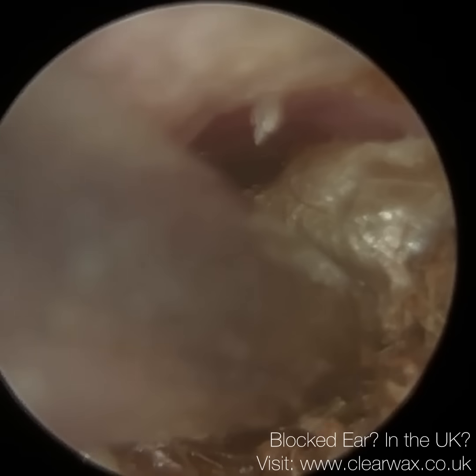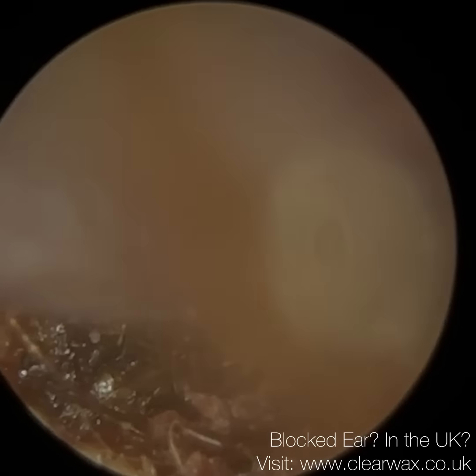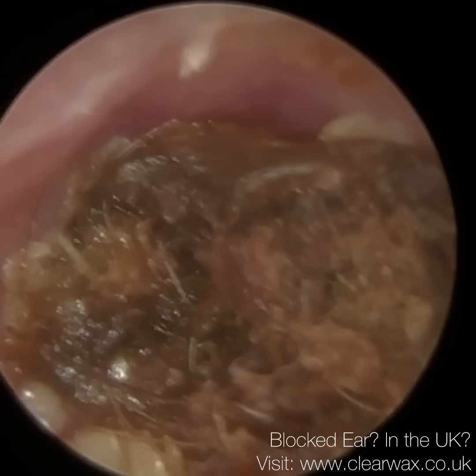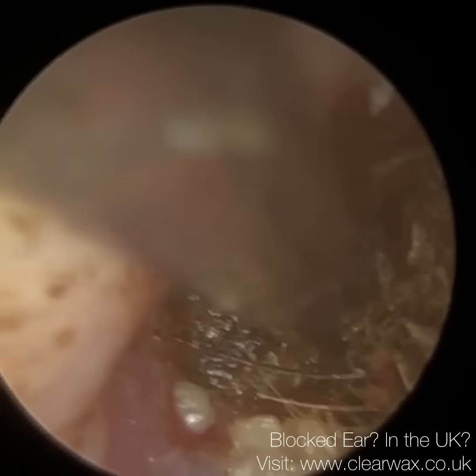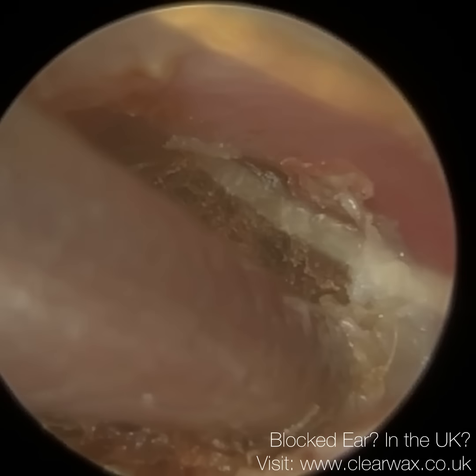We're just trying to detach that which we have. I'm going to slowly bring it forwards. There's just a hair strand there in the way. There's a bit of an opening posteriorly. I'm just trying to separate the plug from the roof of the ear canal, so I'm just dragging it downwards. But it's here at the bottom.